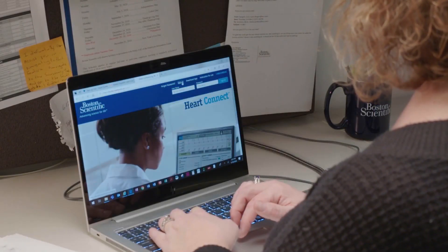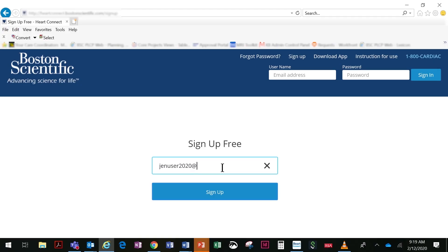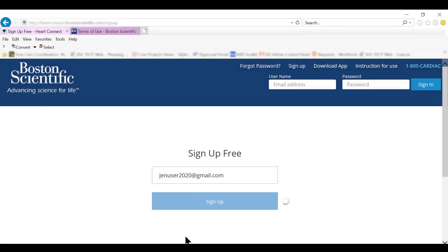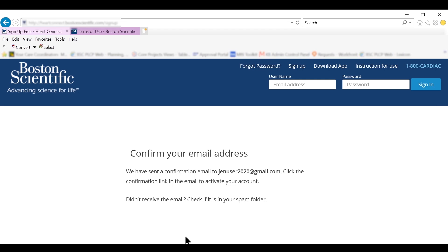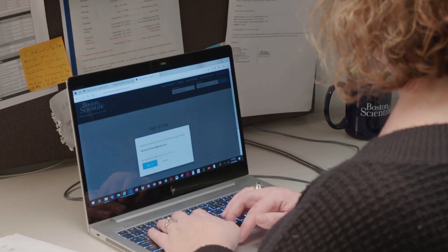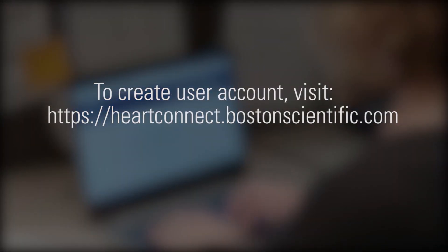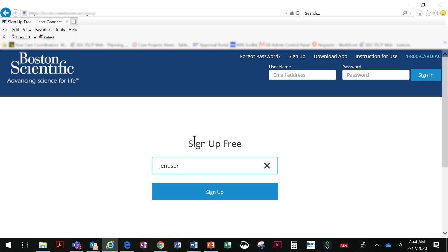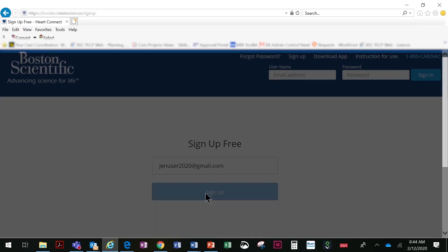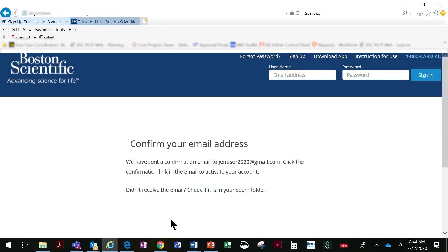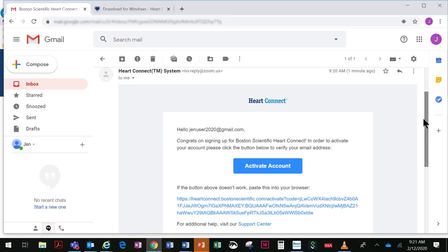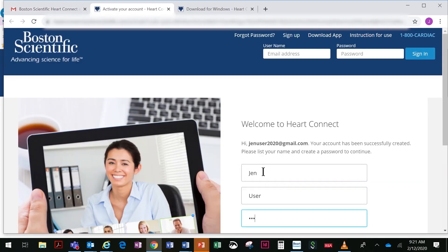Remote users access the HeartConnect Remote Software application on their own computing device. A user account is needed to sign in to the HeartConnect application. Once complete, the remote user can receive meeting requests or join existing meetings. To create a user account, go to heartconnect.bostonscientific.com and select Sign Up. Enter your email address, click Sign Up, and confirm your email address in the email message. Then enter the required account information to complete the account setup.